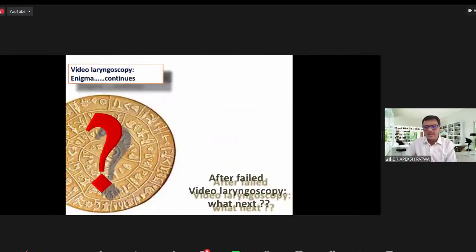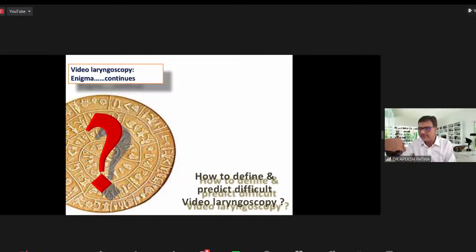Like, what to do if we fail with video laryngoscopy? What next? We don't have enough evidence. Should we go ahead with another video laryngoscope, or should we go ahead with direct laryngoscopy? We don't have a clear-cut evidence-based guideline for this question. How to define and predict a difficult video laryngoscopy? Till date, we have only two or three publications in this direction.